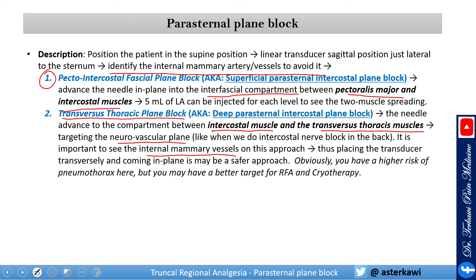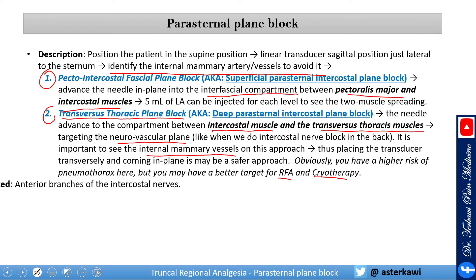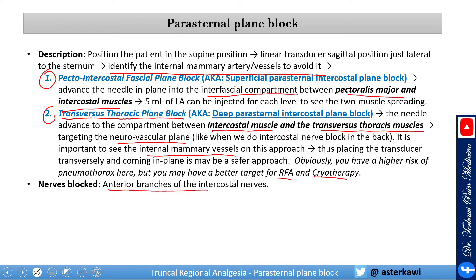What we are blocking here is the anterior branch of the intercostal nerve. Whether you use the superficial or the deep approach, you should capture both the medial and lateral sub-branches.